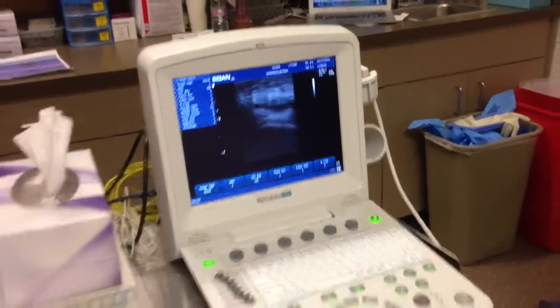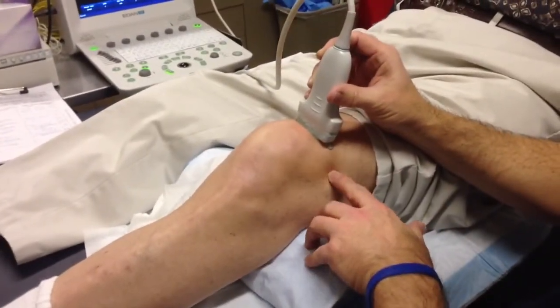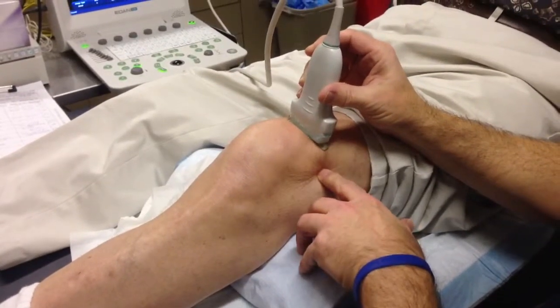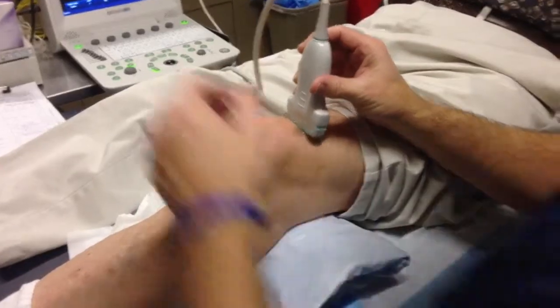Come back and show the knee one more time — you can see I'm going for just this soft spot in between here, and that's our entry point right here. So that's where I'm going to go in. You can pause there. Just be careful.